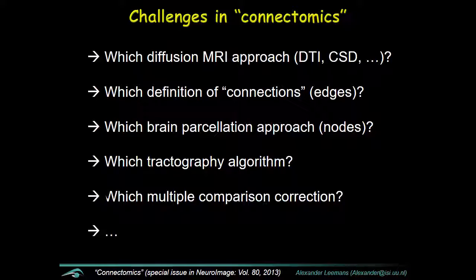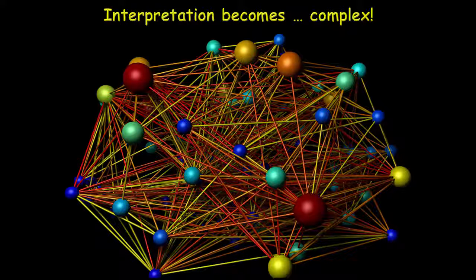We haven't even discussed, what about the multiple comparison correction? Okay, I'm not going to dive into this now, but we all remember the early days of voxel-wise analysis in diffusion, right? Or even in fMRI, it's still debatable in many ways. It's Bonferroni, family-wise error correction, TFCE, there's cluster approaches. Well, what about network analysis? There's a lot of hypotheses being generated. How do we correct for that as well? One thing I can say is that many peers of mine find that the artistic value is still higher than the scientific one. Okay, so it's kind of problematic, but again, there's opportunities to progress here.